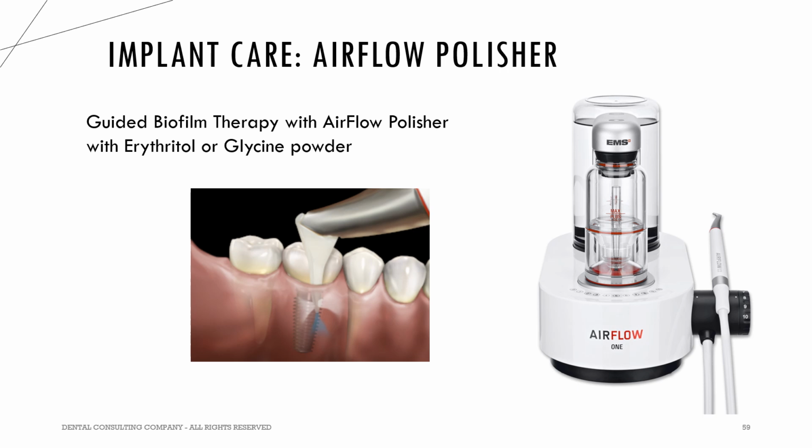A more recent phenomenon and heavily researched area is airflow polisher or guided biofilm therapy. This uses regulated warm water, compressed air, and very fine powder materials to effectively and gently remove biofilm from the surface of teeth and implants. Recently, this is something that a lot of clinicians are using to maintain tissue health.